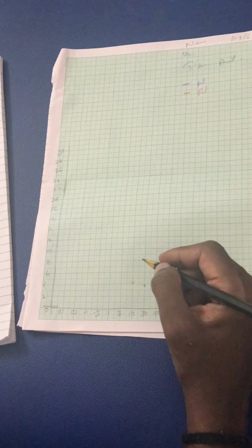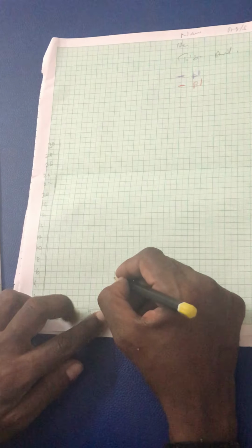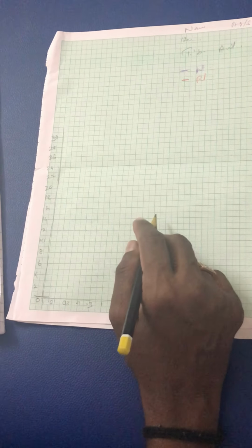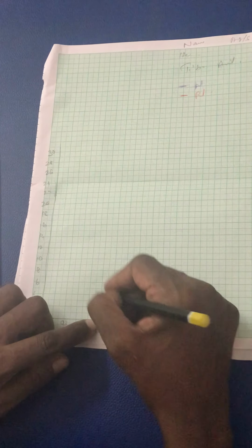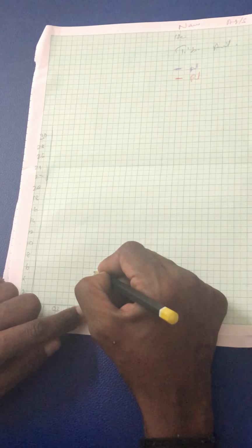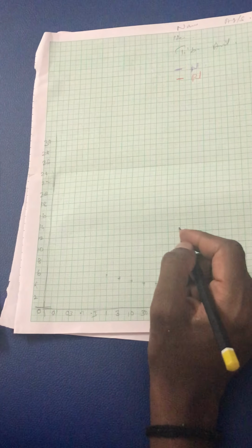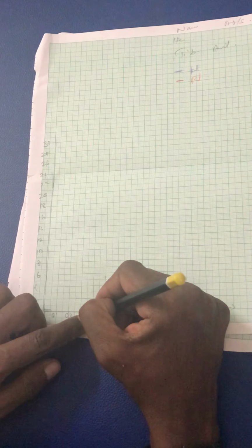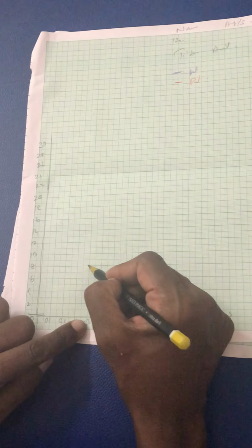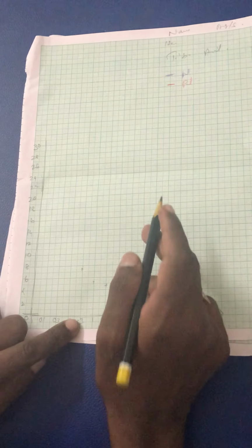4.3. The next, 3, is 4.8. So this is 3 and this is 5, so it is here at 4.8. And 1 is 5.4. Here this is 5 and this is 6, so it is here. Then 0.3 is 7.5. This is 8 and this is 7, so in between these two, the midpoint is 7.5.